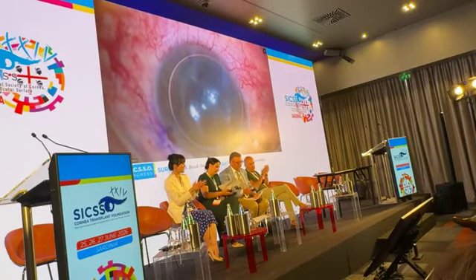One drop each. And this is atropine. So, Dr. Bozak, we want to thank you for this excellent surgery. We're going to move on to the panel discussion. Sure, we appreciate you being part of the program. Thank you. Thank you, sir.